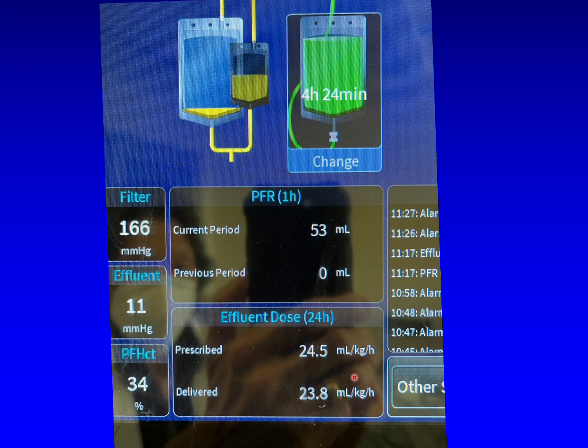So it's up to the nurses to meticulously record each of these, such as the intake of pressors, propofol, antibiotics, tube feeds, etc., and the output of urine, surgical drains, chest tubes, etc. Then the machine uses all of this data every hour to recalculate for the coming hour how much negative pressure needs to be applied to the hemofilter to create that ultrafiltrate of 25 mLs per kg per hour.